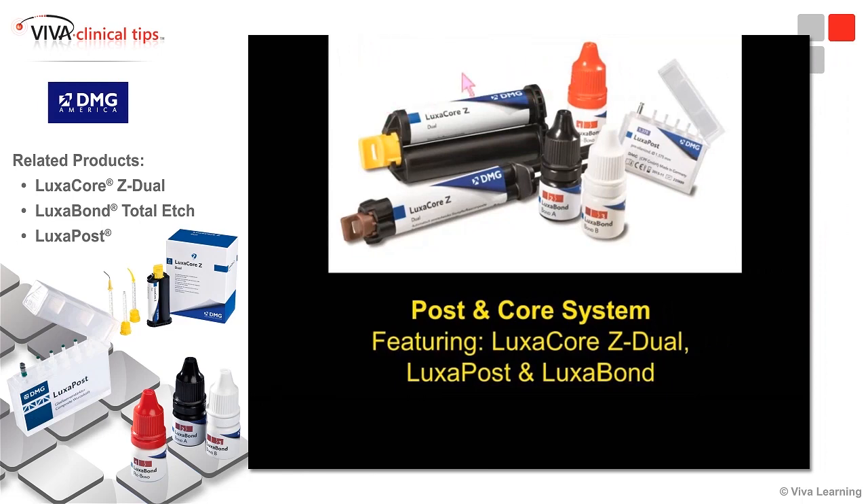This is a system developed at DMG for posts and cores: the prefabricated glass-reinforced composite post with the appropriate burr to create the space needed, the dual cure bonding system Lexabond, and it's going to be used with LuxCore Z.